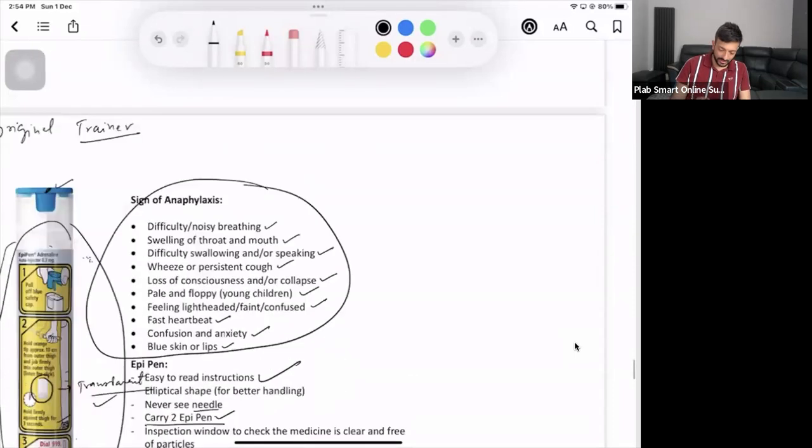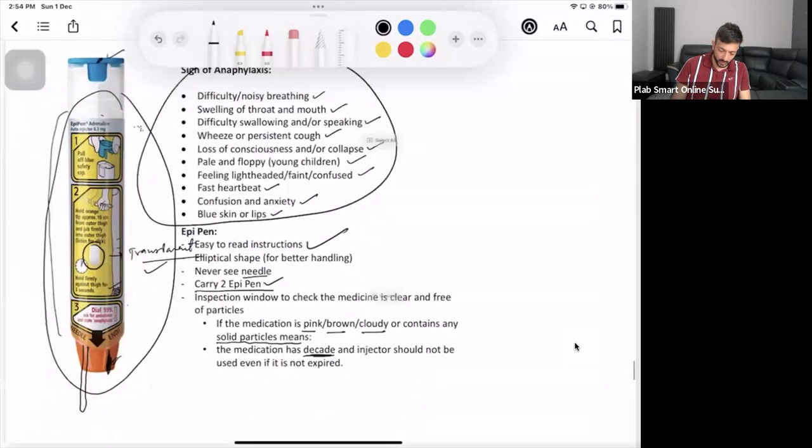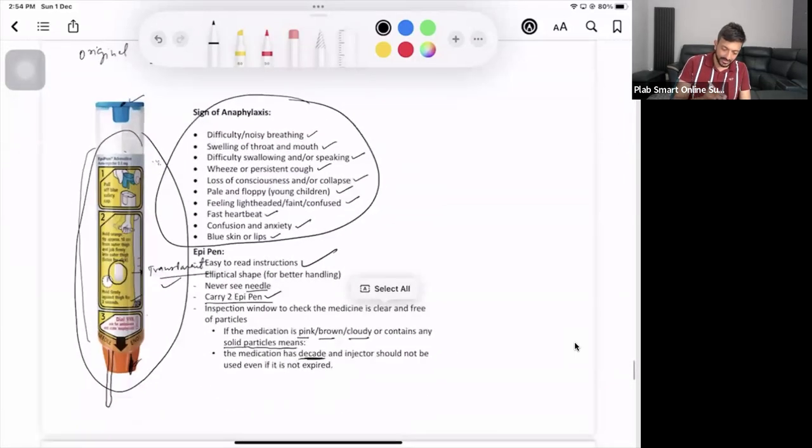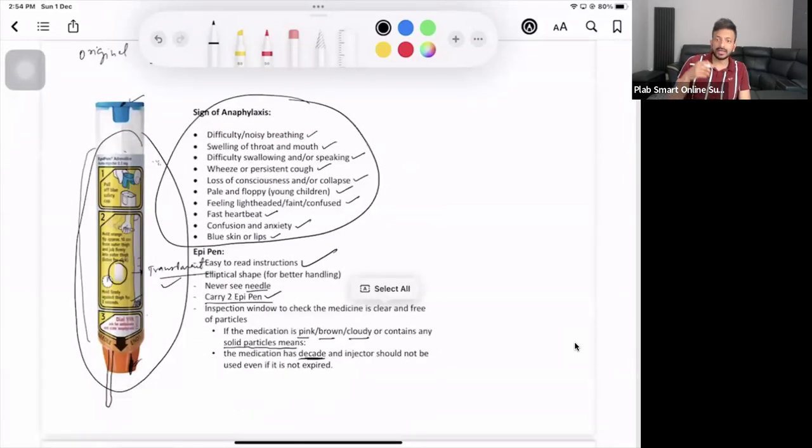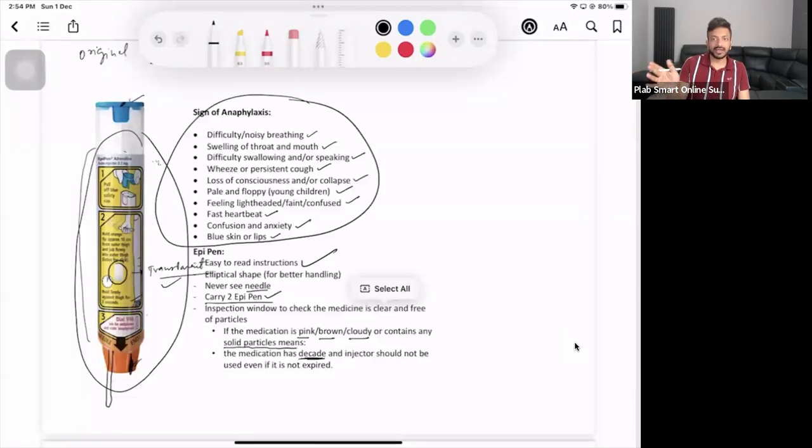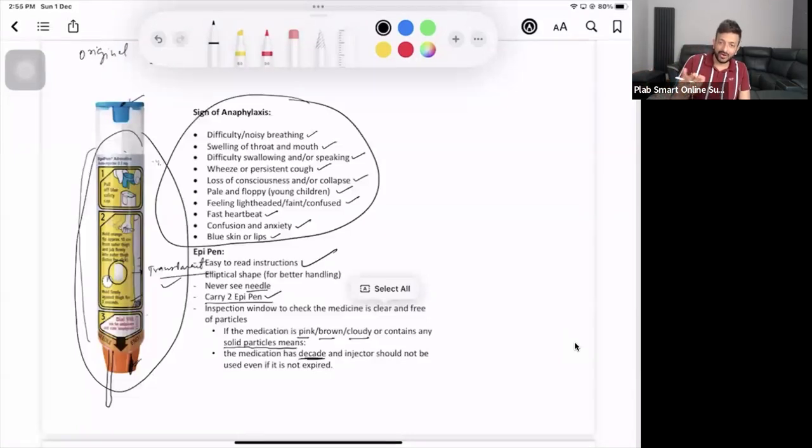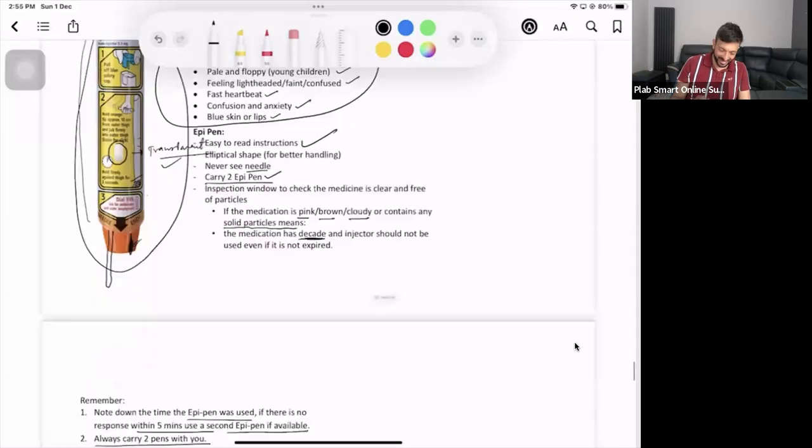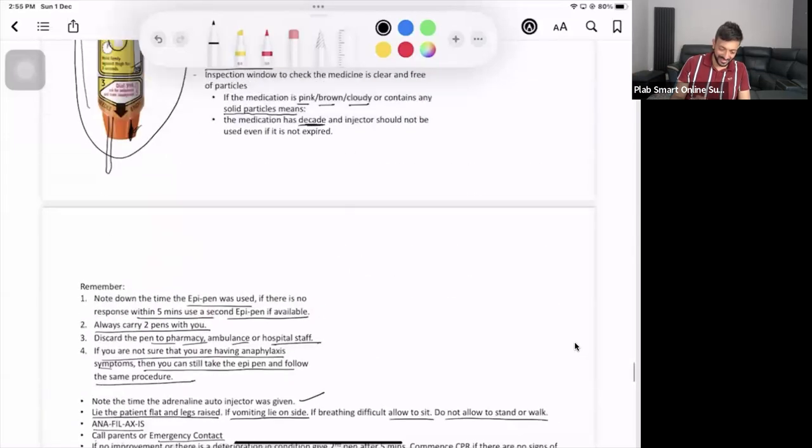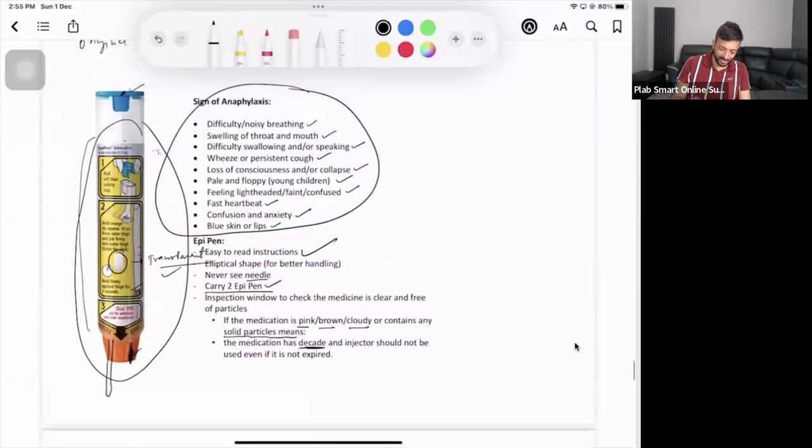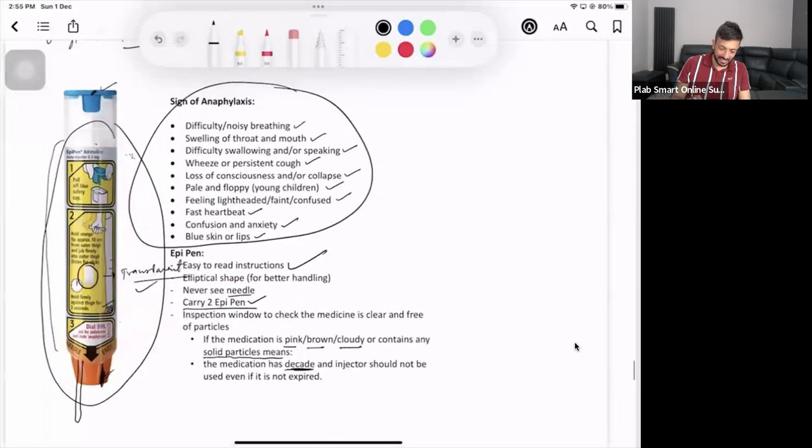That's the thing that you need to do. It's the easiest one. And if it is a trainer, as I said, inject it, you can show on your leg as well, that's fine. It's not going to have a needle, don't worry. But if it is original, obviously you don't try. So that's what we have got on EpiPen and anaphylaxis.